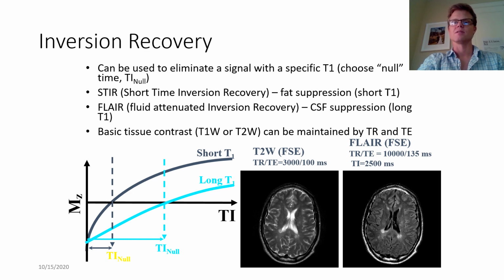And actually then you can see these, what I believe are called periventricular lesions, these bright signals around the ventricles that were kind of harder to distinguish from the surrounding fluid without this FLAIR method to suppress the fluid signals.